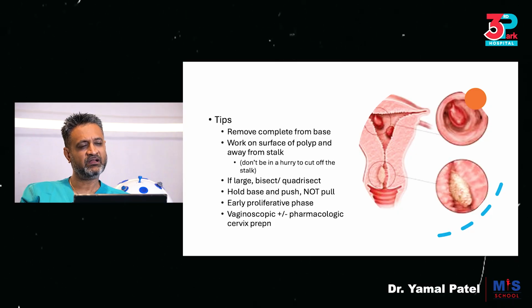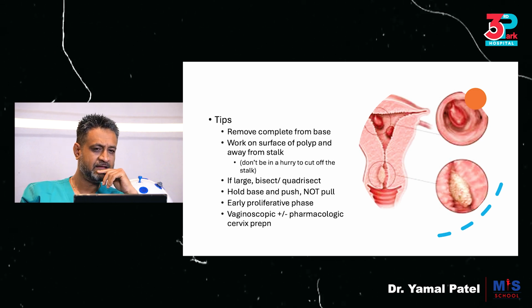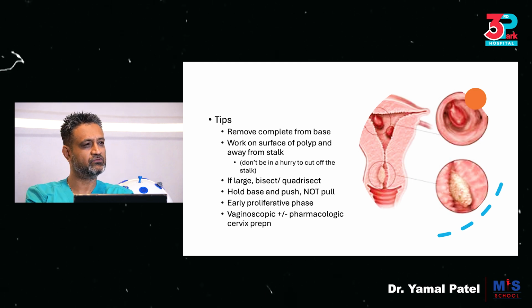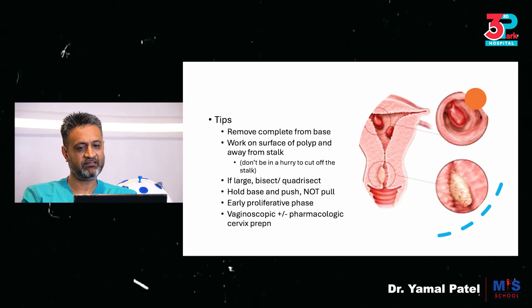If it is small, you can work differently from when it is a large polyp. One of the tips is, please understand you have to remove it completely from the base. Just cutting it off, leaving the base, will only mean that it will reform and regrow over a couple of months to years, and you will get a recurrence.